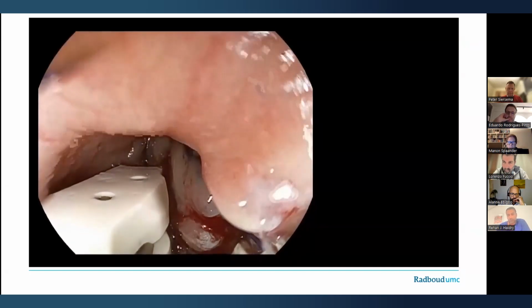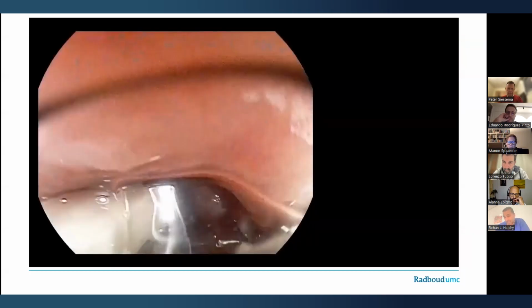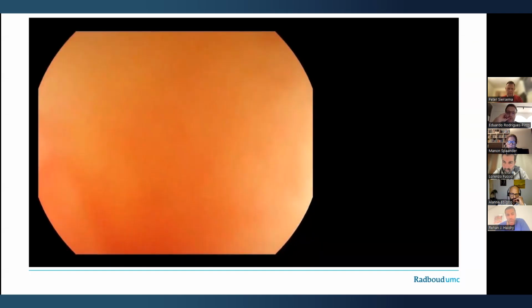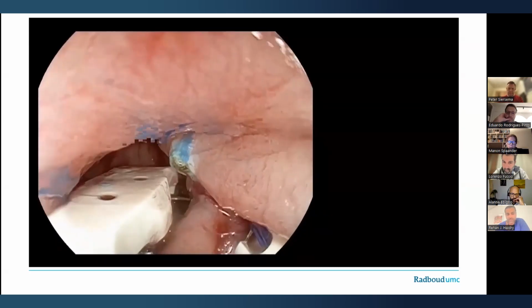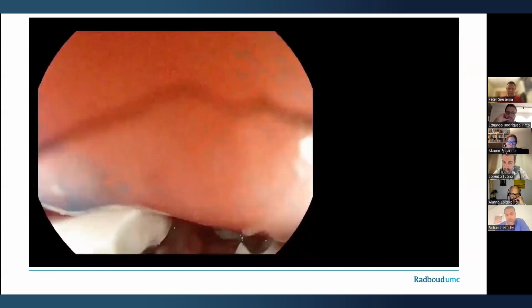Sometimes I find that an on-table esophagram is not dynamic enough. So if there is a small leak there, you can't see it. And so with this device, you can go in a very systematic manner. You can see I'm just reinforcing my first suture by taking slightly more generous margins from the defect.